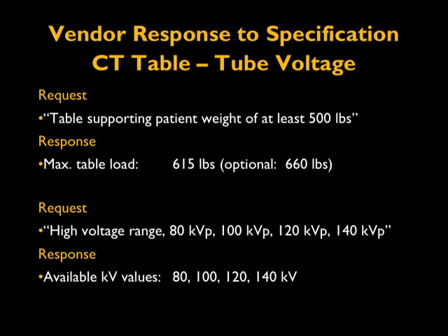The second request is the high voltage range. The clinic wants to know whether the CT operates calibrated at 80, 100, 120 and 140 kV, and the response comes that it's available for all the kV requested.